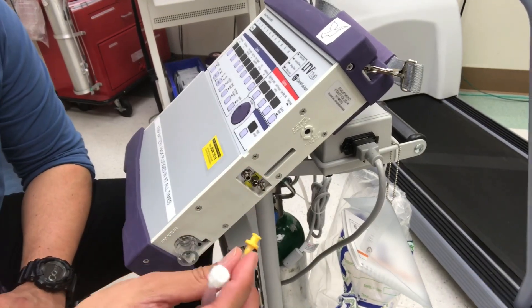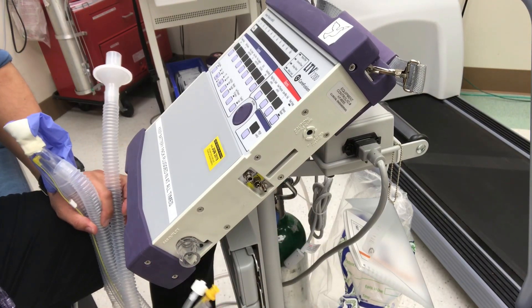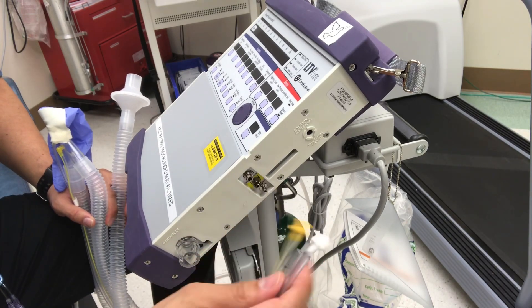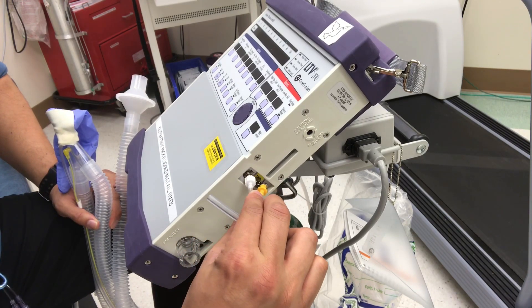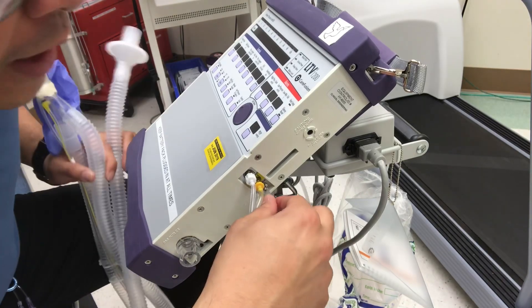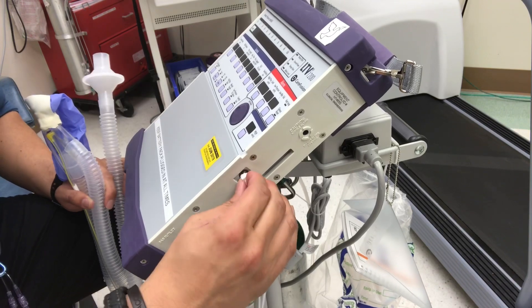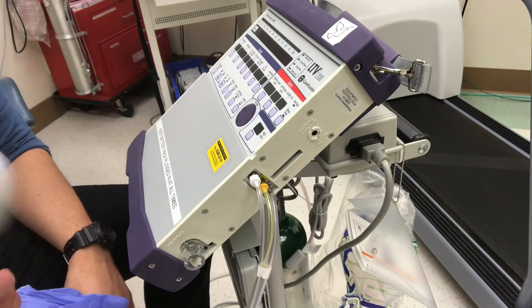We also have these three connectors — these are pressure and flow transducers — and they connect here. You'll notice they are color-coded: yellow, white, and clear. When connecting them, since you'll do a lot of traveling with this vent, give each one a little counterclockwise twist before threading it on so it lays flat. This prevents disconnections, because loose transducers are one of the most prevalent alarms on the LTV.